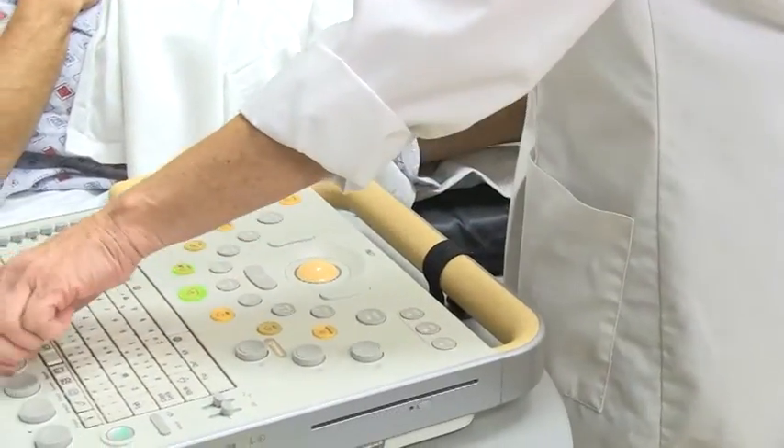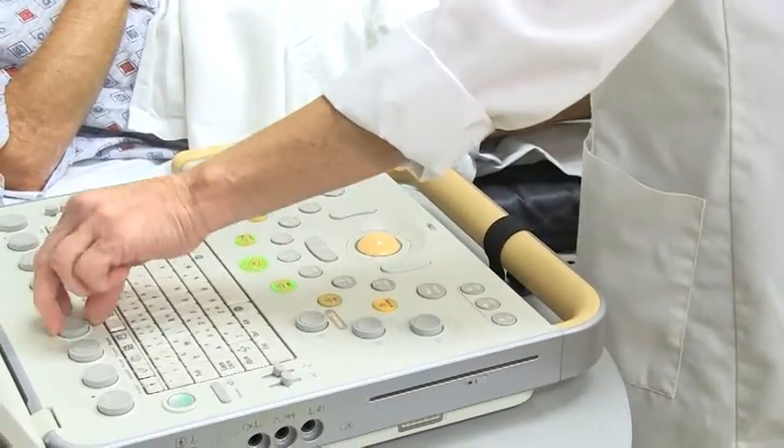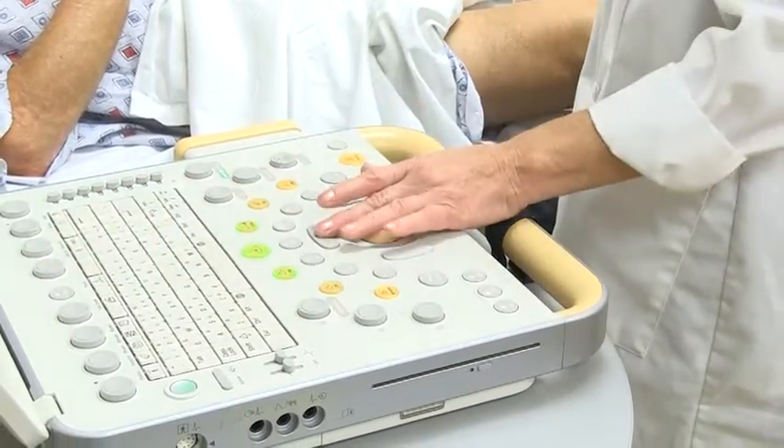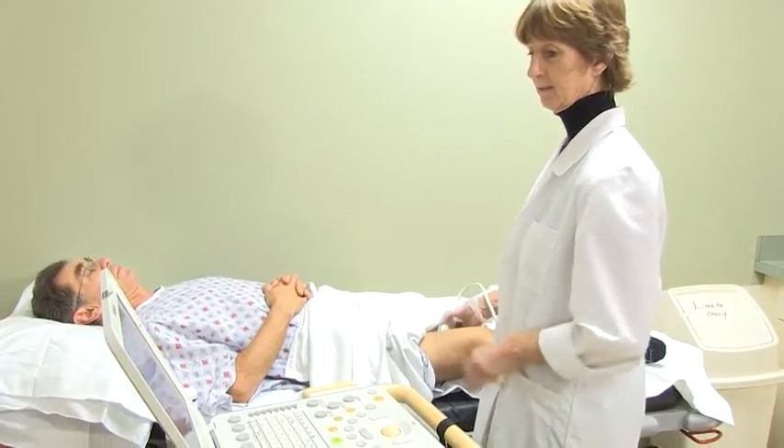Typically, this is not painful. However, if you are already in a great deal of pain, it may be slightly uncomfortable. We will do our best not to cause any undue pain or stress while performing this exam.